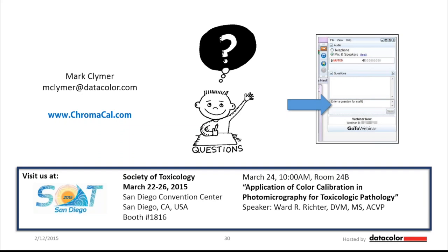I think I've shown in this example during my presentation, we actually used Visiopharm to analyze those images, and we clearly saw a difference between the linear system and the nonlinear system. I think it's really important to be aware that it can have an impact on your results, and I think that's reason enough to have a linear imaging system going, really.